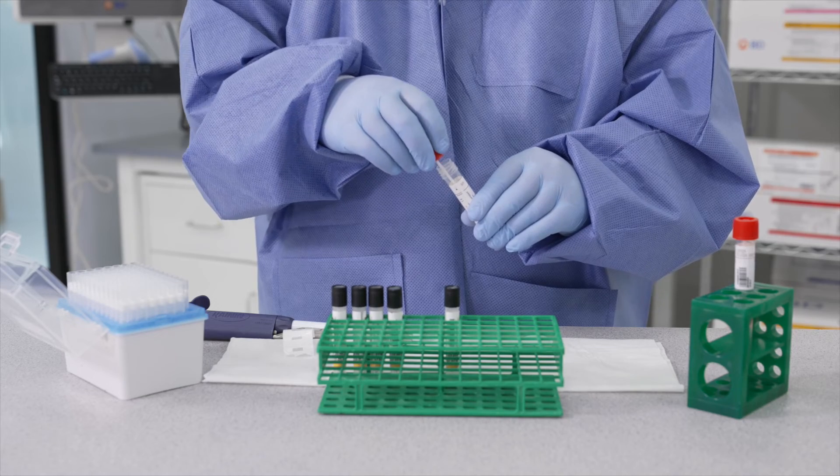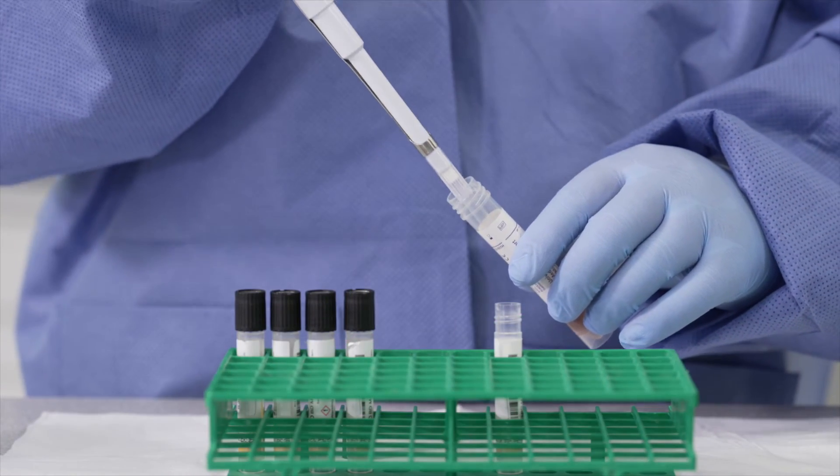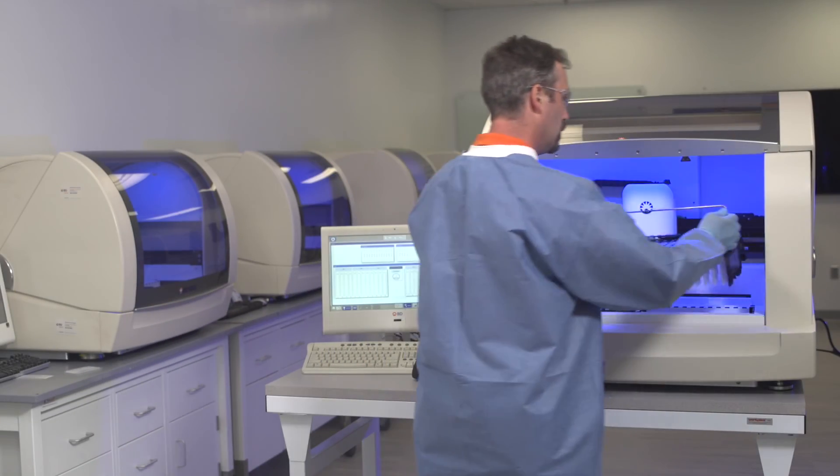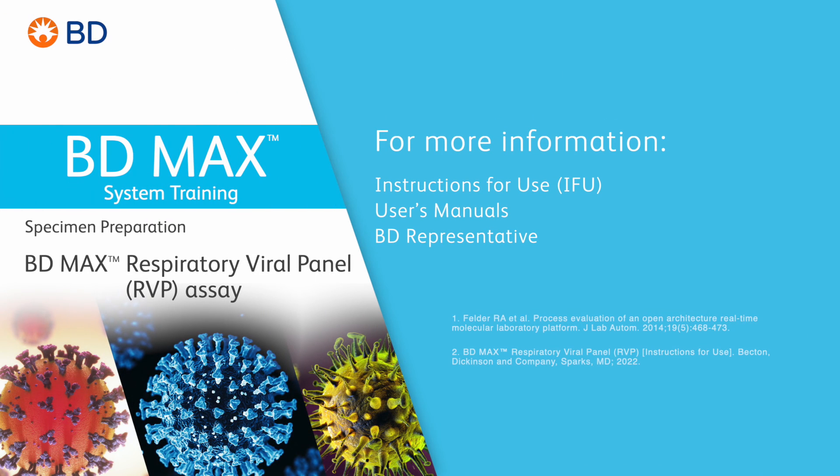We hope this program has helped familiarize you with proper specimen preparation of the BDMAX Respiratory Viral Panel, RVP, on the BDMAX system. If you have any additional questions, please consult the instructions for use, user's manuals, or your BD representative.